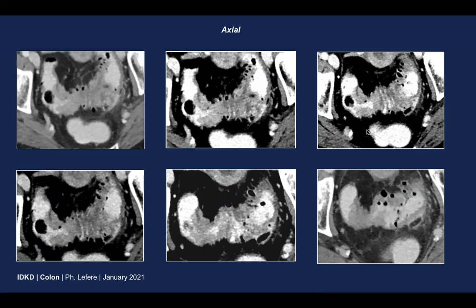Another interesting feature is allowed us to see by the positive contrast. We see the contrast distributing between the narrowed folds, whereas we don't see any folds in the second distal wall thickening — absence of folds. And here we see some pericolic infiltration at the first zone, whereas there is no pericolic infiltration in the second zone.